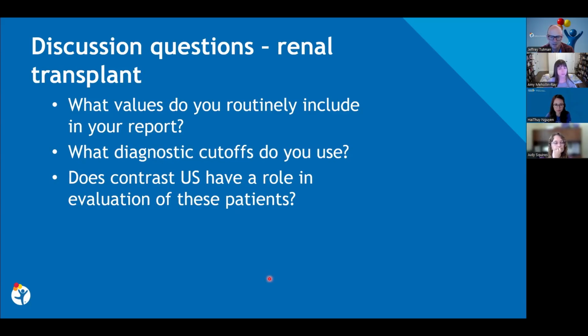Yeah, I definitely agree that they're generally more straightforward. And we typically have all these post-op exams that get done serially. So patients kind of become their own internal control. We compare what's going on over time, which is definitely a benefit as compared to renal artery stenosis, where you just have that single snapshot and try to figure out what to do with it.